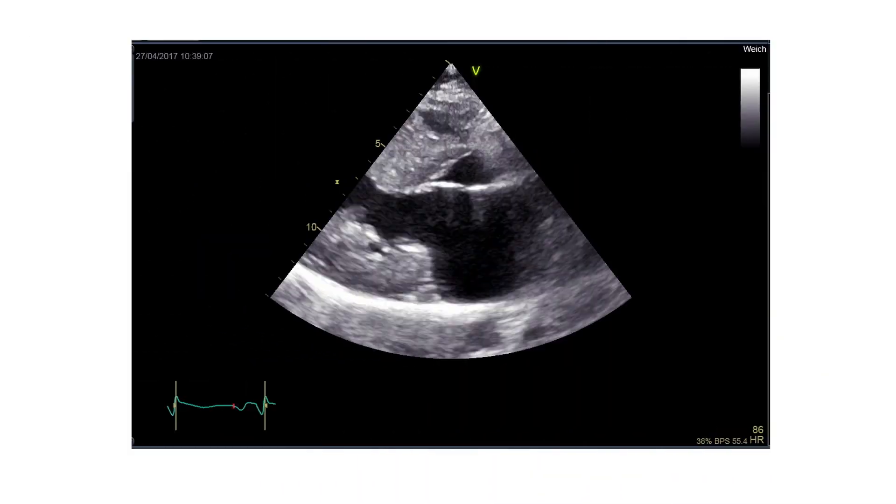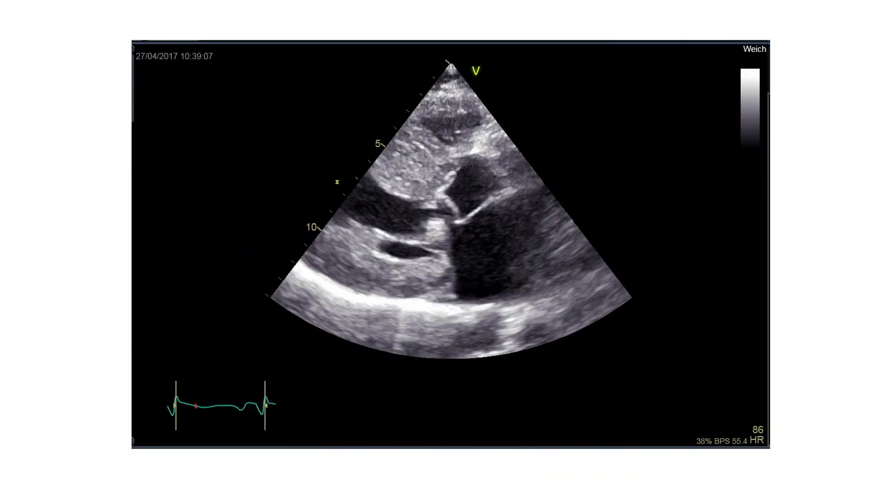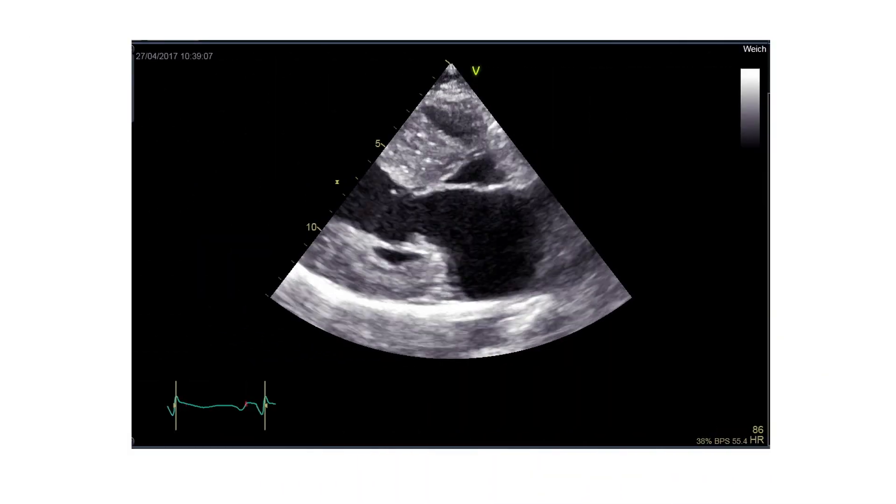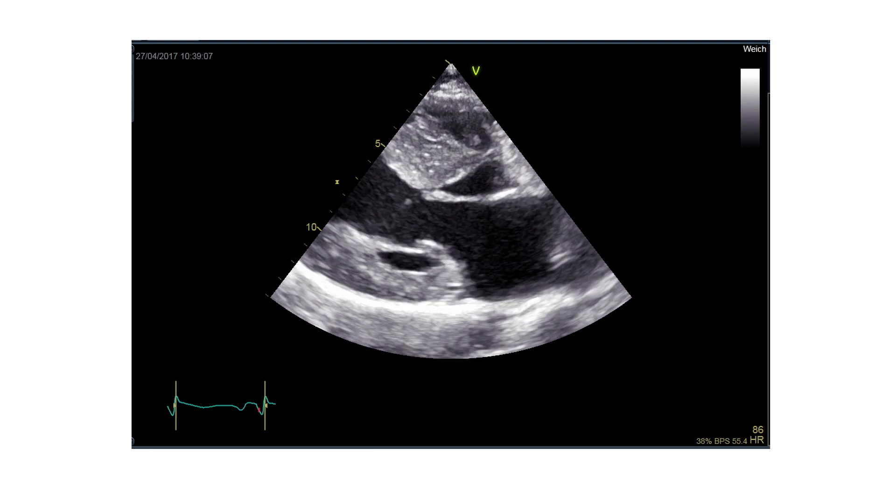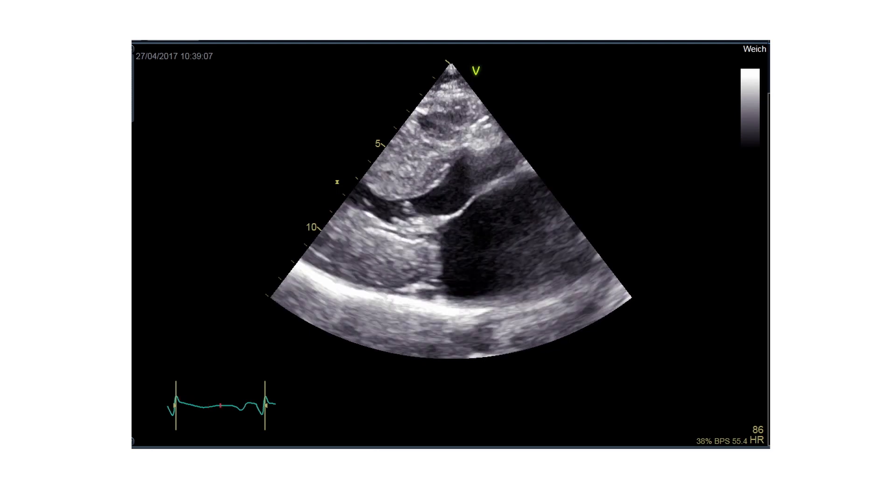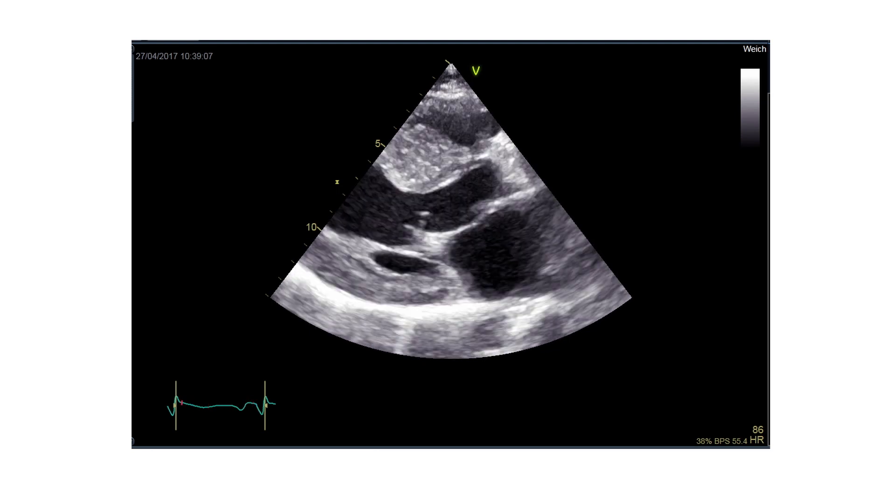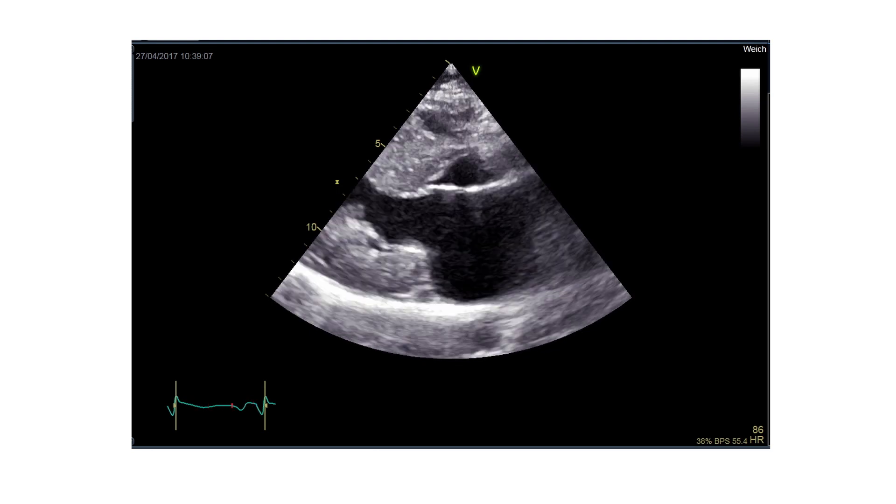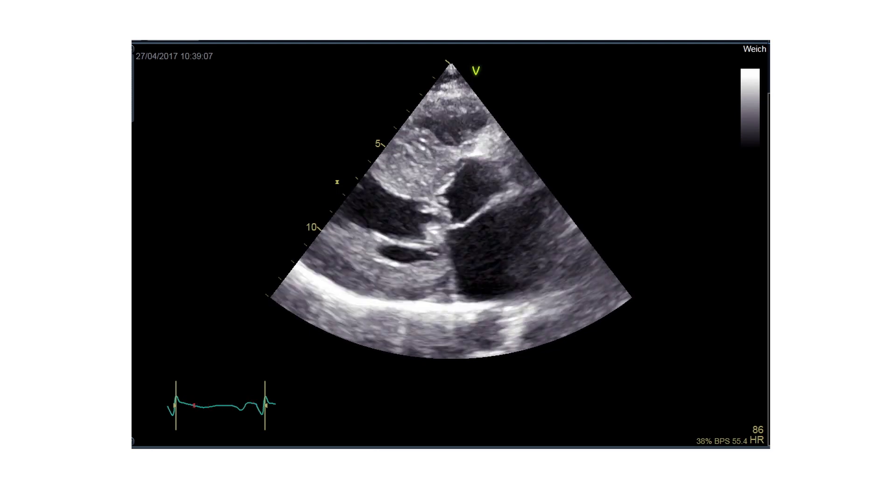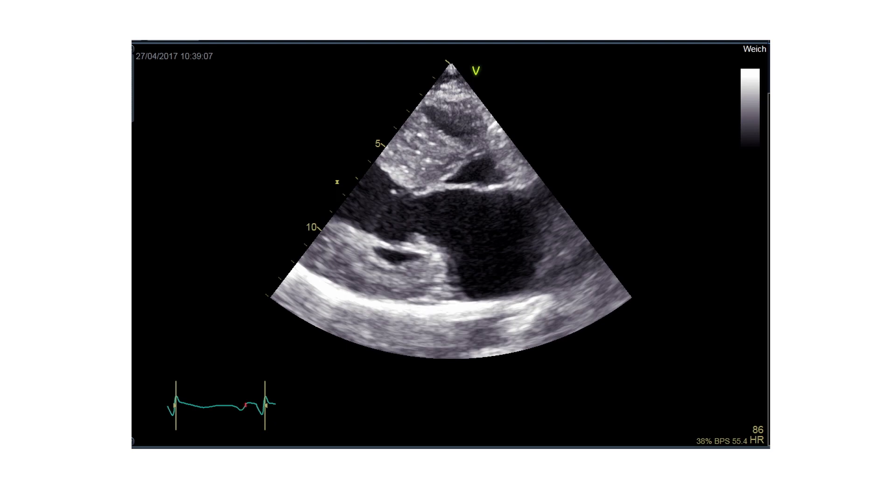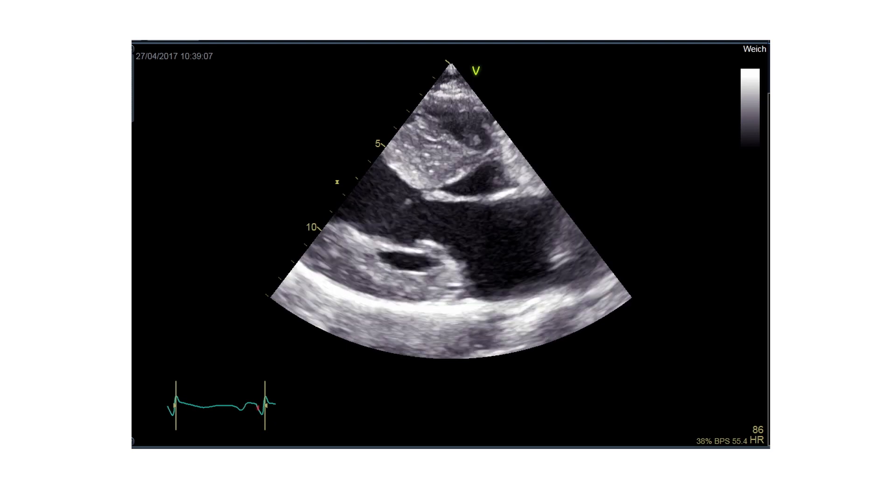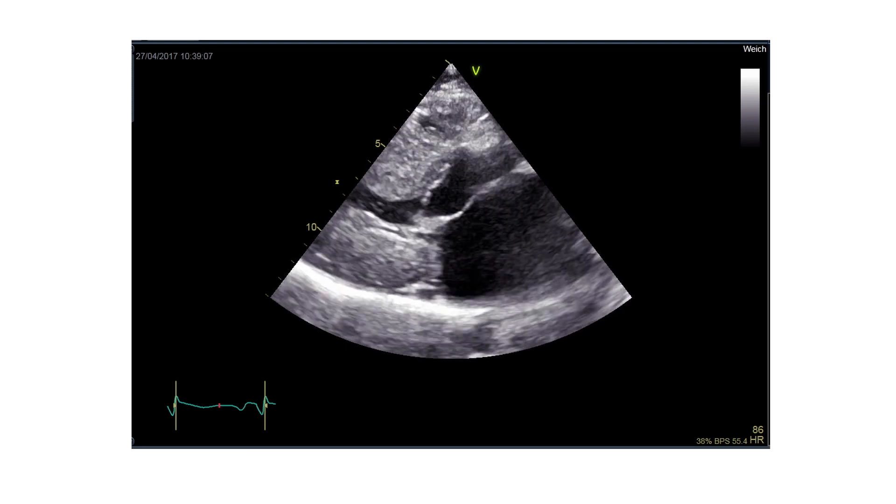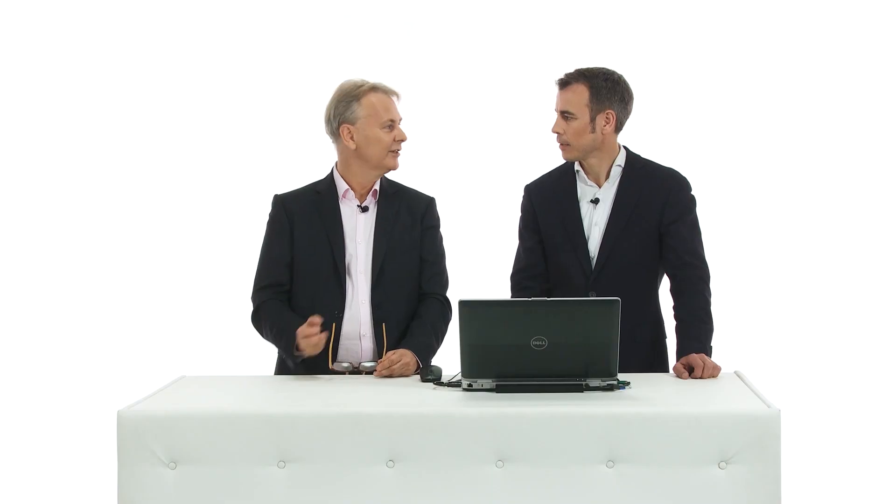So this is the first transthoracic echo that was performed. The diagnosis is quite clear—it's hypertrophic cardiomyopathy, and we can see two features in this case. Pretty massive SAM, actually. I rarely see such a spectacular form of SAM.